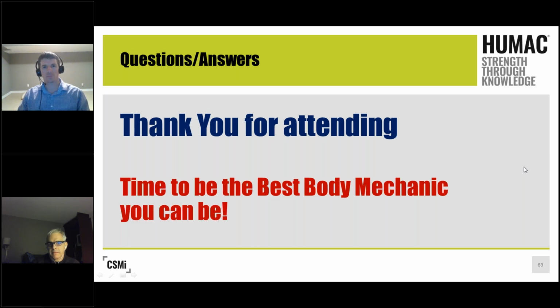And never during those aspects am I going to ask them to give me maximum contraction. I'm going to train them up to 25% of their effort, then move them between 25 and 50%, and then 50%. I'll look at what they're generating during that aspect and make sure they're able to generate force appropriately before we take them to that next step. It should never just be push as hard as you can. We should train them into those avenues.